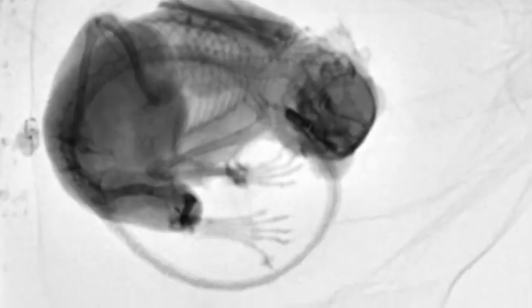So I came up with this ingenious way to irradiate more squirrels with one shot just to get this done — it was basically an experiment to see and compare them. One of these squirrels actually has some previous pathologic fractures, which you should be able to spot. Seeing as how I'm talking to the video, I really can't see these pictures too well, so I'll have to let you figure those out on your own.